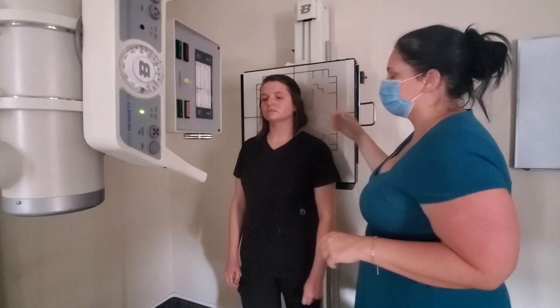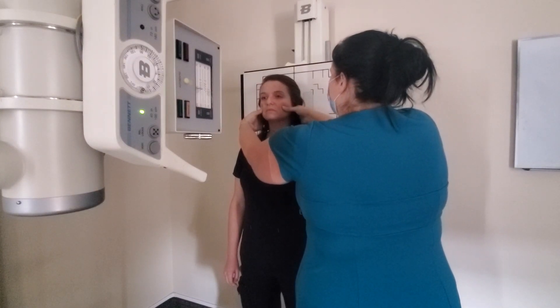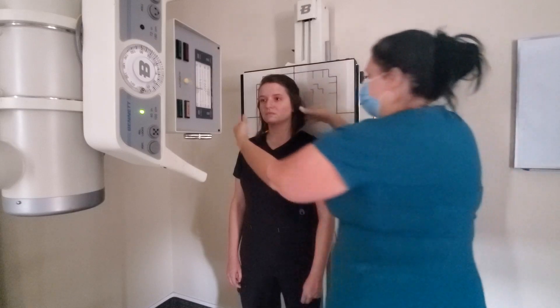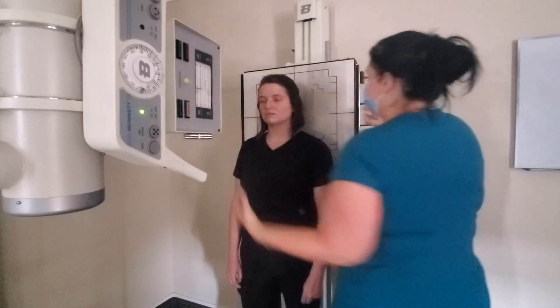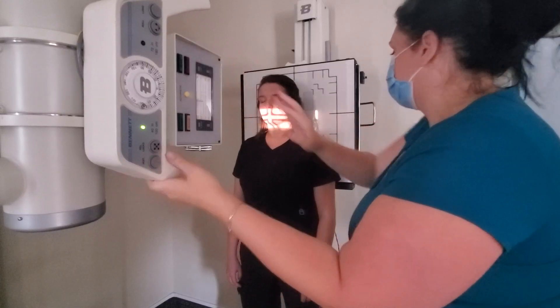For the AP open mouth, you're aligning the mastoid tip to the base of the cranium and the upper incisors. I always take my hands and feel the back of the patient's cranium and right below those zygomatic arches, and just tilt a little bit until those fingers are aligned parallel to one another. Almost everybody goes down just a tiny bit.